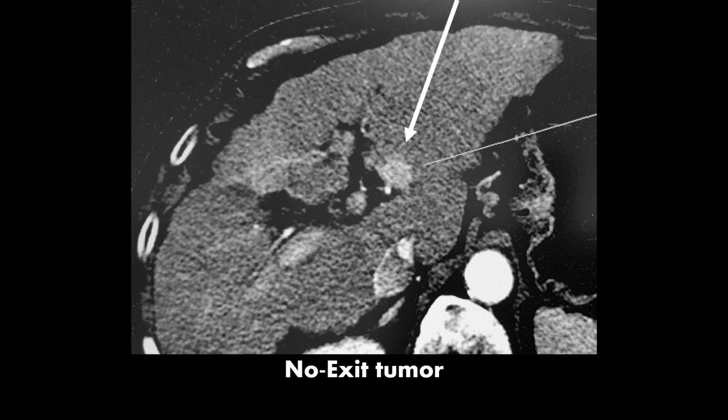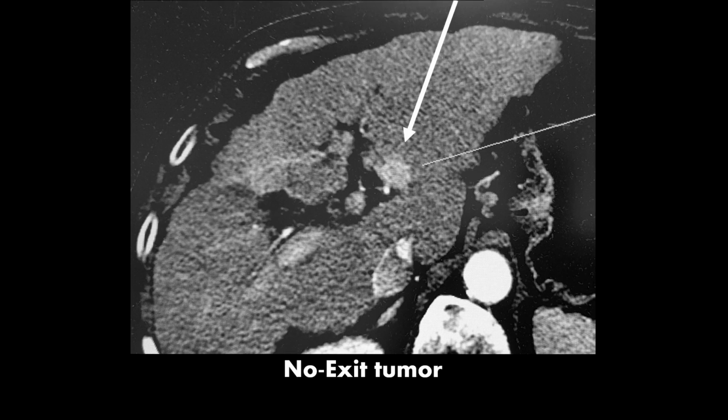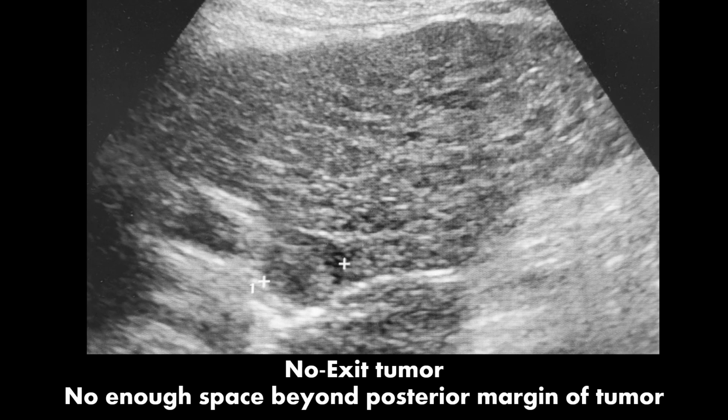What about this case? There is no space beyond the posterior margin of tumor along the potential electrode path, so we can call it no exit tumor. This is quite common in our daily practice. For this kind of no exit tumor, I would recommend not to use the central through puncture.